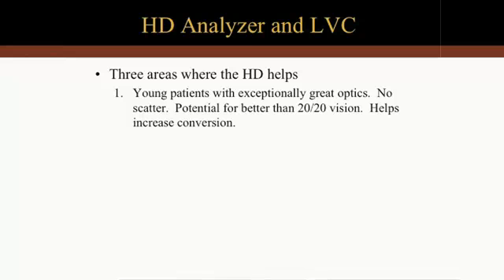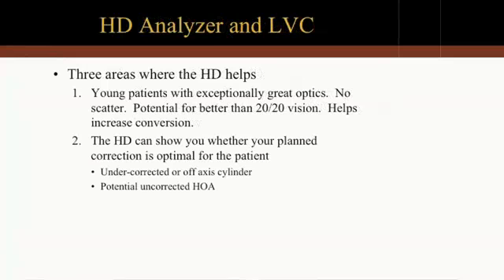Or I can say, I can make you better than 20/20 in your right eye, but you have some scatter from that little PSC cataract in one eye, and I can't in that one, and I can show them the difference. So in my LASIK practice, it's really valuable because it tells me what expectations my patient and I should have. I know with my excimer laser and on the things I've done, I can deliver getting rid of nearsightedness and astigmatism and some farsightedness. But I needed that variability on which patient I could put their expectations high versus low.